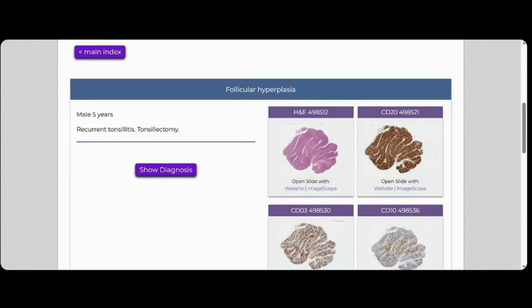So this is reactive tonsil, actually. And we can look at the germinal centers. You can see that there is a variety of size and shape of the follicles. It's obviously follicular, looking at it at low power. So you've got follicular structure at low power. This is clearly not lymphoma so far, but we need to look at these in more detail. Do these look reactive? Even at this power, we can see many features that mean these are reactive, and we're seeing these features not just in one follicle, but in many follicles.